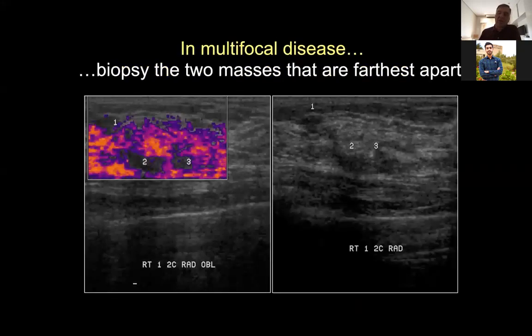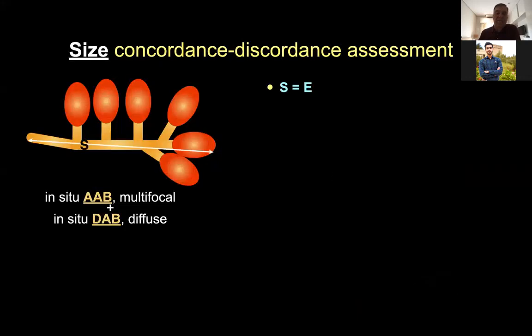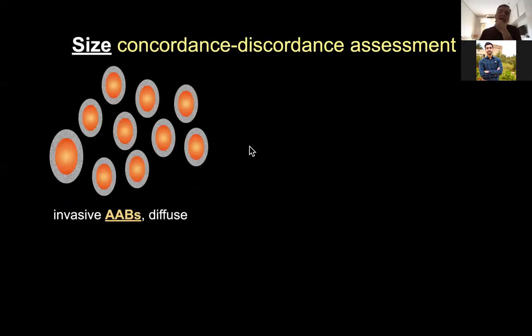And here I'm just showing that I would vacuum TDLU number 1, vacuum TDLU number 3, and then I could say, yes, there's multifocal invasive ductal cancer or multifocal DCIS or some combination thereof. Now, when we have a lot of DCIS that's cancerized lobules, again, the size and extent will be the same. We'll just include the maximum diameter of all the TDLUs and ducts that are involved.